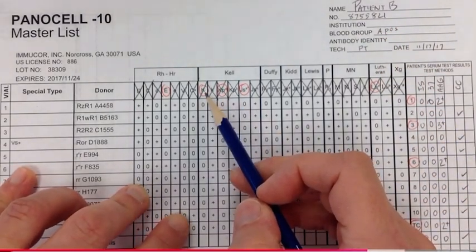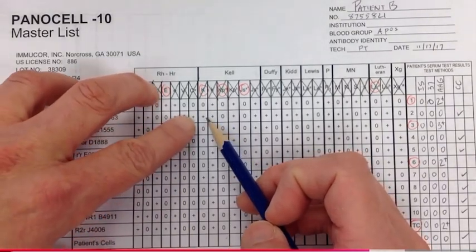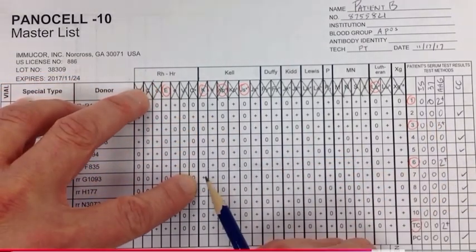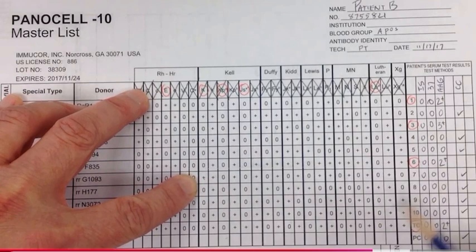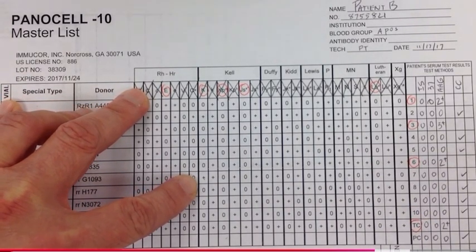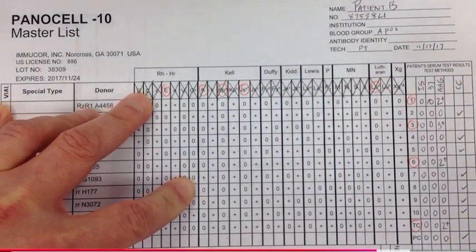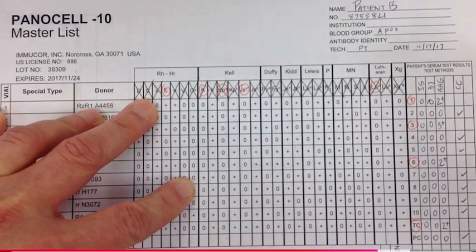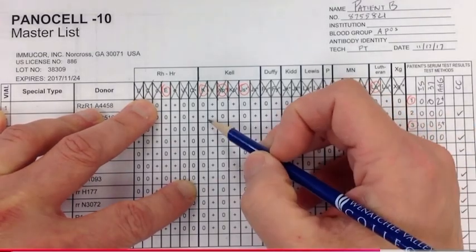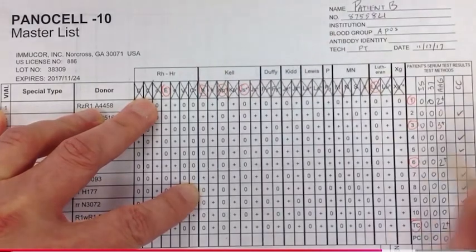Okay, let's go back to Kell here. So now what I was talking about before, about having two negative cells: here we have heterozygous, and that's negative, and we have another heterozygous that's completely negative. So that gives me a little bit more confidence that I can probably rule this one out. Now that being said, two heterozygous do not equal a homozygous, but I'm just interpreting what I see here, and for me, I am pretty confident that this is not big K.